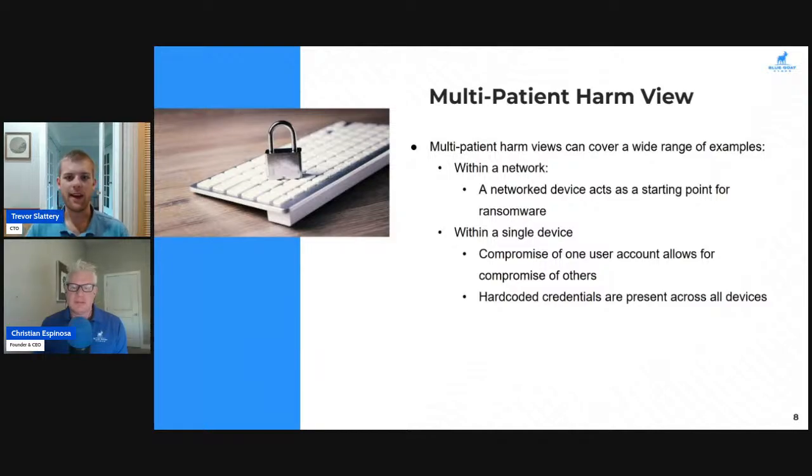They make their own tenant for each HDO, and that prevents the risk of multi-patient harm scenarios by tying it more to an individual organization and having less risk of storing all sorts of data in one place. So there are a lot of different solutions to this. Some alternatives are just ensuring that your access control is extremely well configured in your application, though it can be a little bit of a risky approach since it just takes one problem to essentially lead to this full compromise.